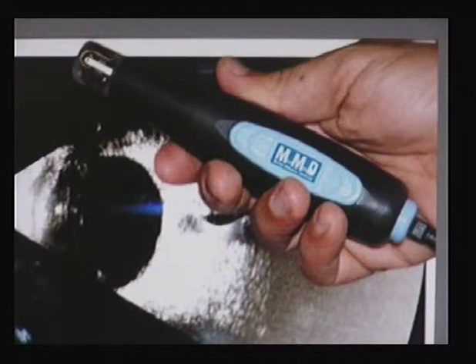This is the next advance — a handheld B-scanner. It plugs directly into your laptop, and I hope to buy one of these next week in San Diego.